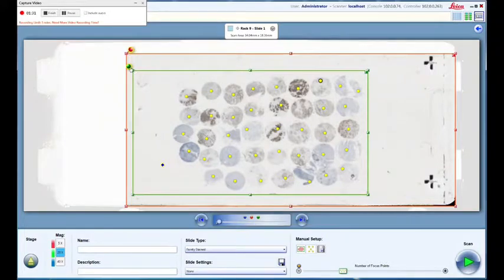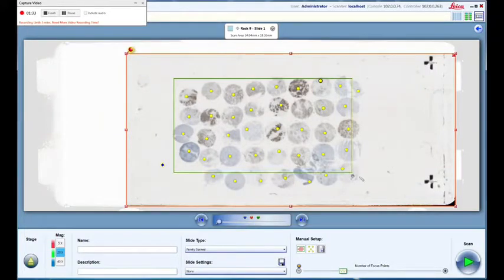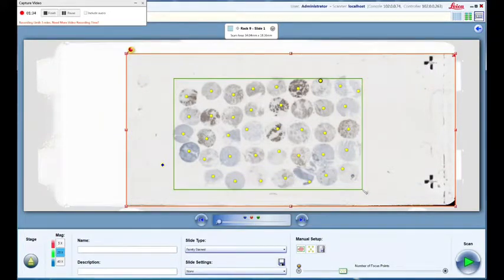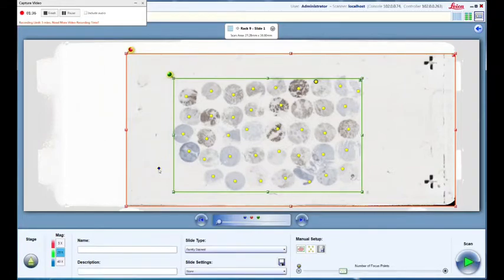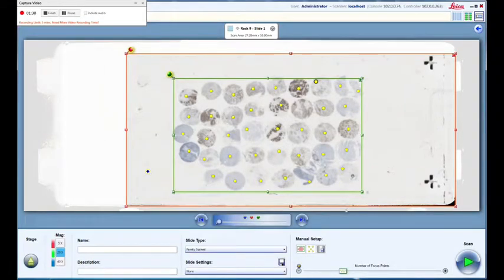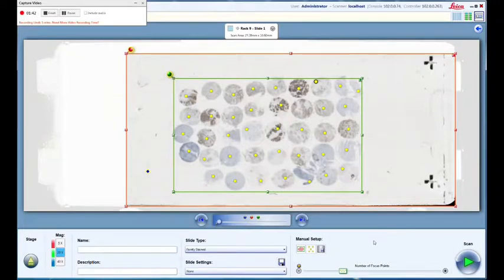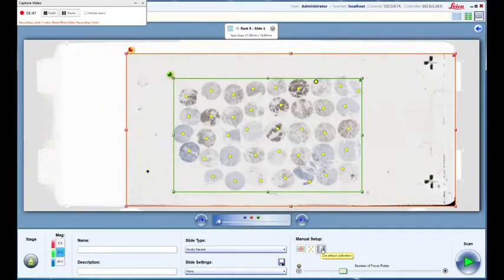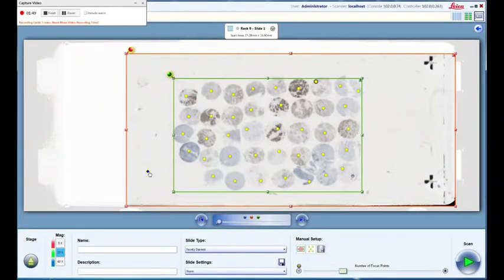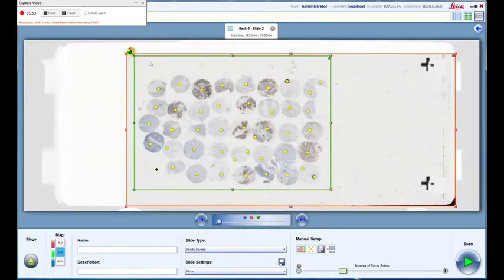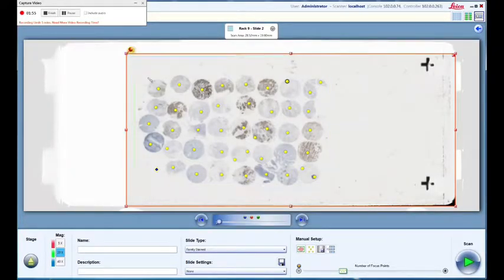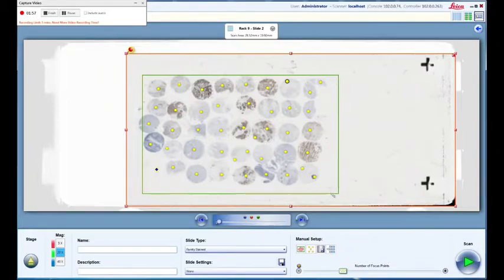Here's the slide, and I'm just going to reselect the area that I would like to take a scan of. Every single one of those little yellow dots is a focus point. Usually the focus points are going to be automatic, and you can select over to the next slide by clicking the arrow here at the bottom.